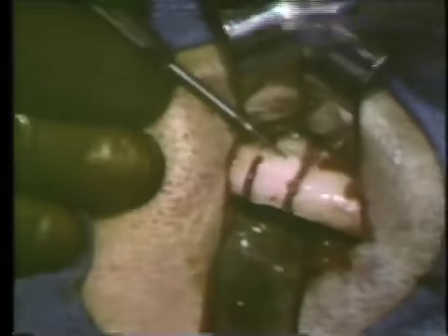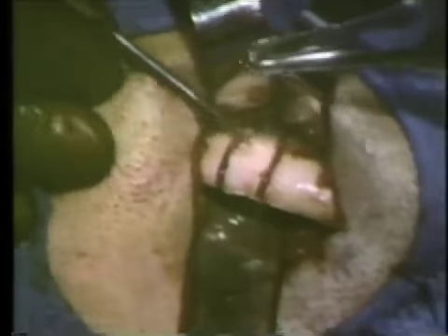By taking these areas of bone off in segments, the fragments are kept under control. The lingual cortex is still intact, and therefore, as we lift off the buccal or lateral cortex, the fragments remain in their correct position, and you'll see later why that is important.